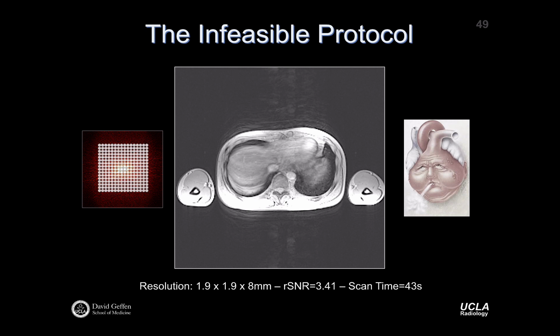And you can pick up some pulsatile artifacts from the aorta, the ascending and descending aorta as well. Mostly this band, and then probably up here as well. A little subtle, but definitely. Okay, so we know the phase encode direction is up-down, and that's helpful. The frequency encoding consequently must be left-right.